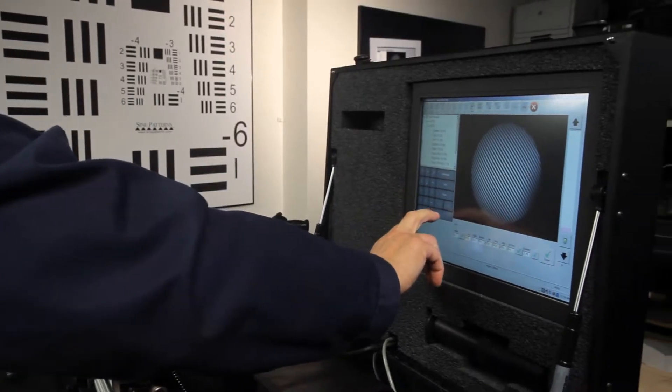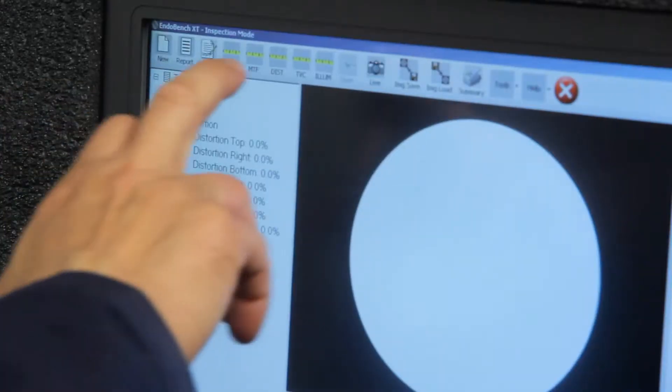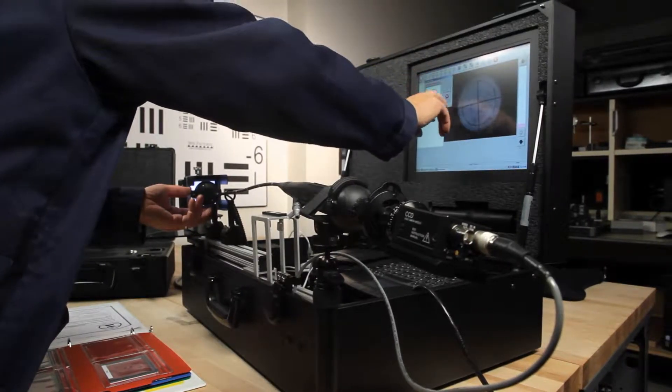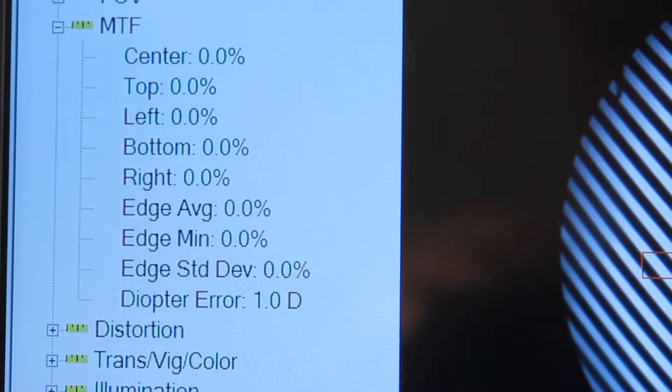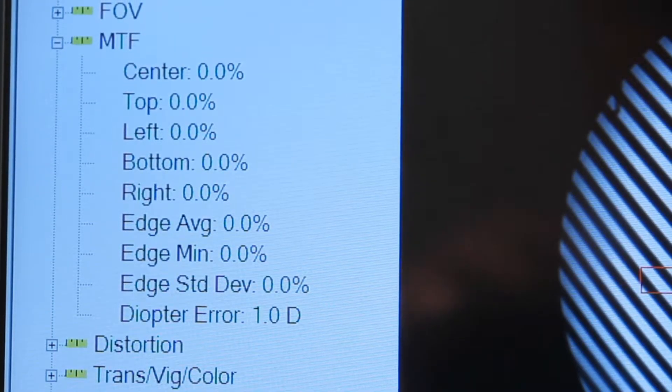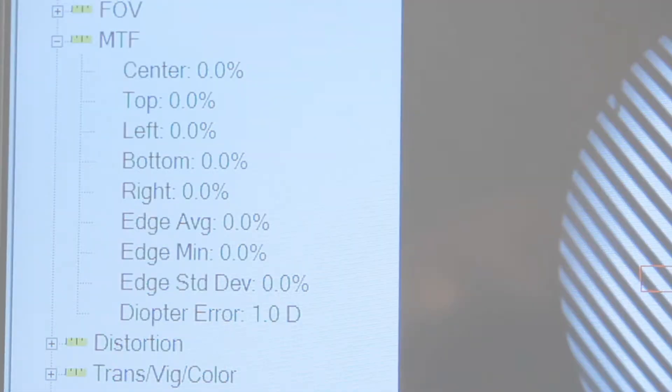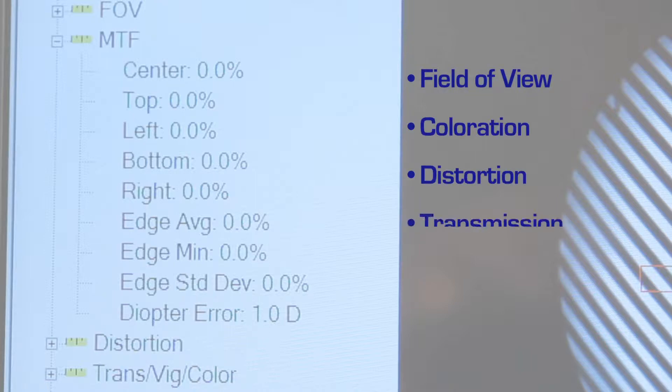Using algorithms developed by Lighthouse Imaging, the machine vision system in the EndoBench performs image processing to generate measurements in a quantitative way, measuring parameters including field of view, coloration, distortion, transmission, vignetting, and MTF.